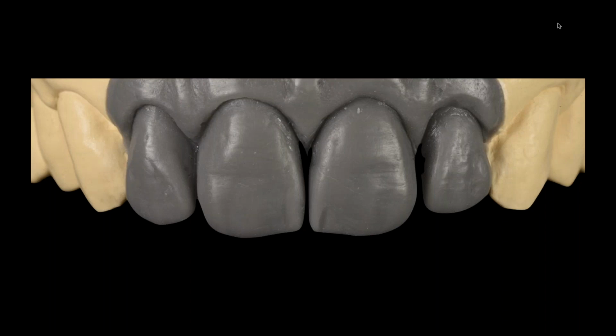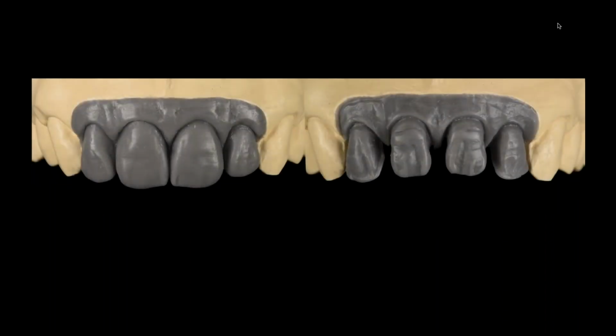But when it comes to true waxing, I have to be honest and tell you that for me, we're still in the hand mode of it. And we're in the hand mode for many reasons. I feel like we can get the most detail, the most contour. And at this moment, it's just easier for us. Now, Jen, who is my partner, might say it a little differently, that she's a little more comfortable sometimes. And as she says that, I can tell you she's sitting on her bench right now waxing up a case. So we like the ability to still do things by hand. And actually, the case she's waxing now is for the upcoming course that we have. This was actually a similar one to what we had done in the course I did in London.